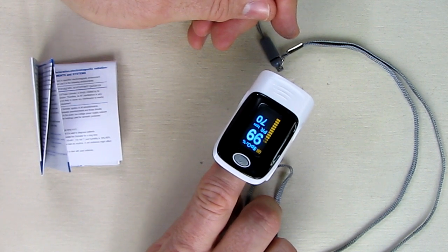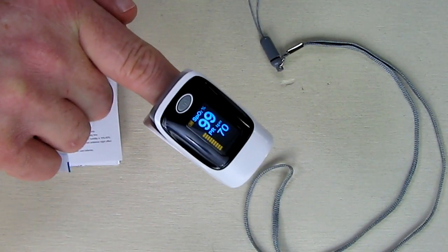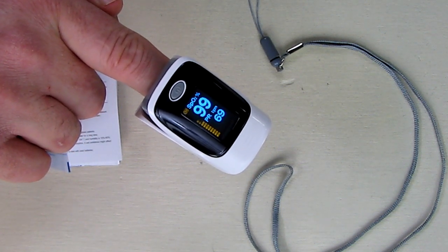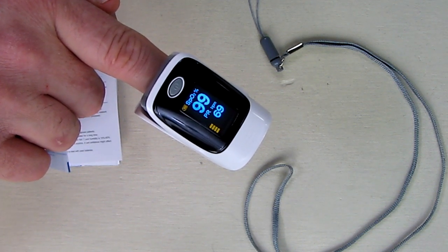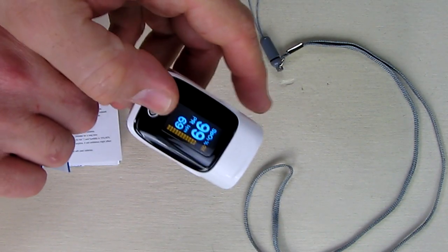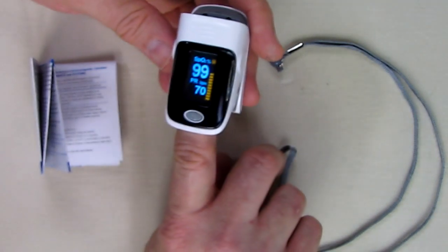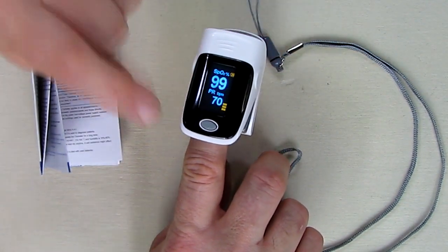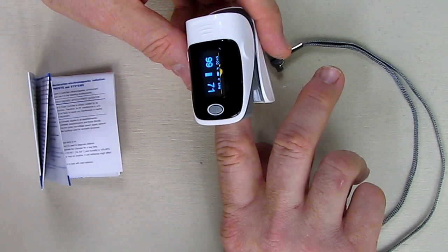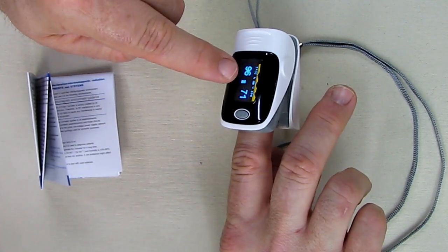Right away I can see the little pulse going on, which is neat. It's showing 99 percent oxygen and my pulse rate is 69 to 70. You can see the visual display showing the intensity of my pulse rate. Hitting the button again changes the display direction — now the camera can pick it up easier. You can see 99 percent, there's the pulse rate. Hit it again and it goes sideways, and now there's a little graph display on the top showing my pulse rate going across the screen.